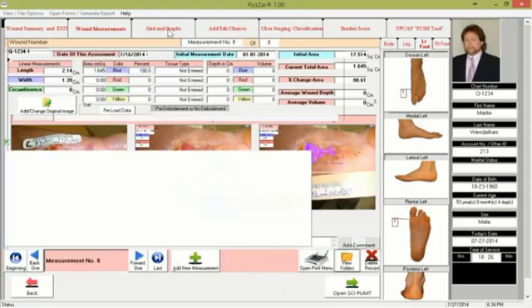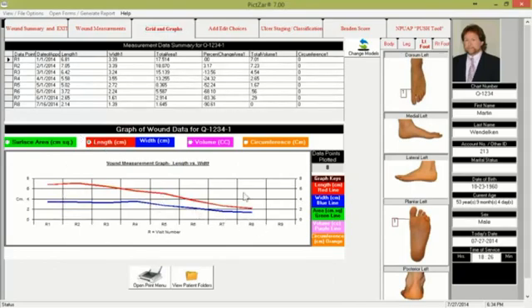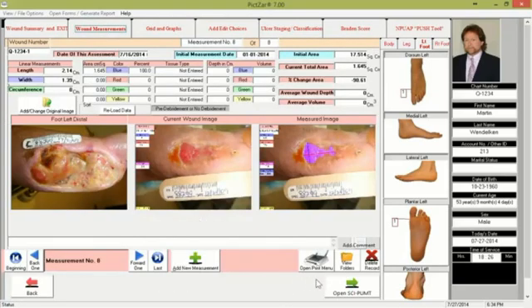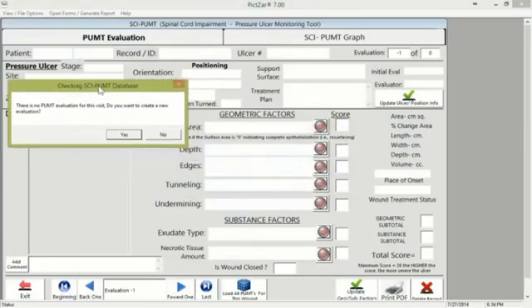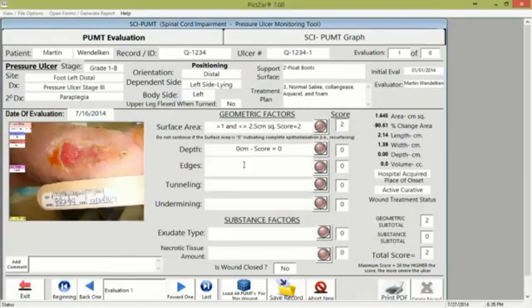After clicking 'save image,' the data and images become part of the patient record. I then click the next tab to have a quick look at the data grids and graph, viewing the area, length and width, and volume of the wound. Having made my measurements, it's now time to create the PUMT evaluation. I go back to the measurement tab, click 'open SCI-PUMT' at the bottom, and the program notifies me that there's no evaluation for this wound yet — everything is empty. I click 'yes' to create an evaluation for this particular visit.